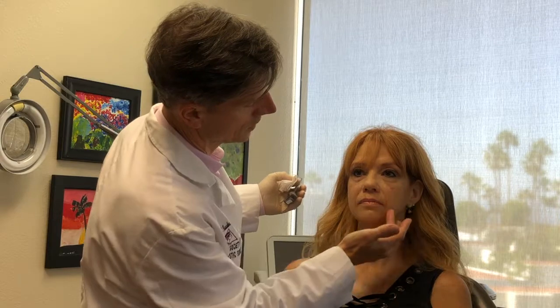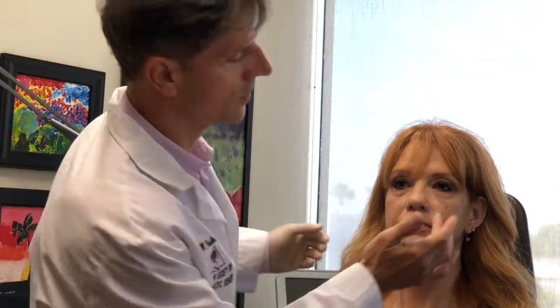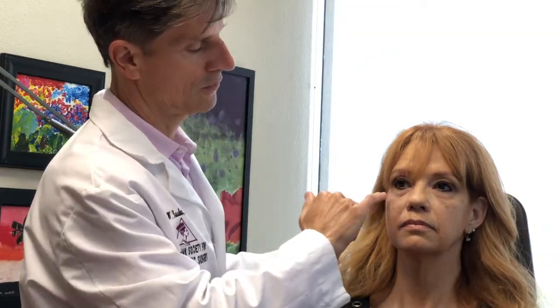On the left side we see a very nice contour of the cheek with improvement up into the tear trough area. We have a slight deficiency along the orbital rim, so we will place a small volume there, coming from the lateral and staying under the cheek skin. We will always aspirate and slowly inject as a depot technique — again, softening in that tear trough. With this degree of improvement, they could now justify a Volbella at the tear trough, but we are going to stop at this point.